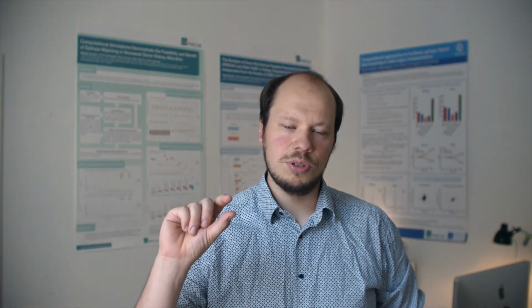If you want to use the score for your clinical application, please make sure to switch to the clinical mode. A very interesting new feature that is available in the lab mode, since version 3.0, is that you can provide more loci as presenting and more loci as presented.